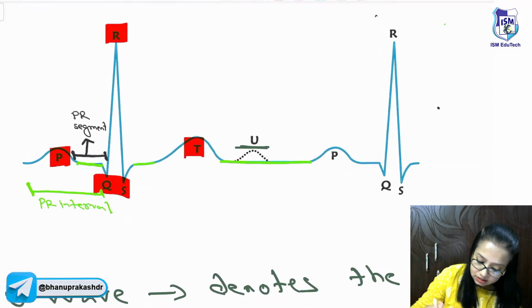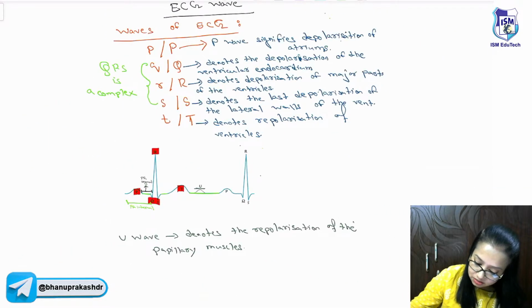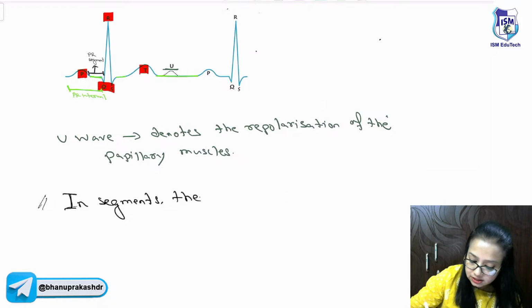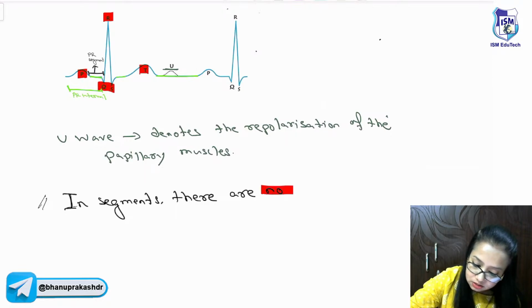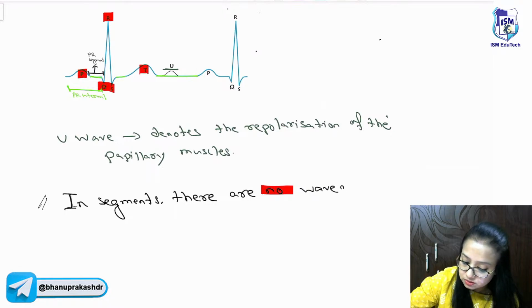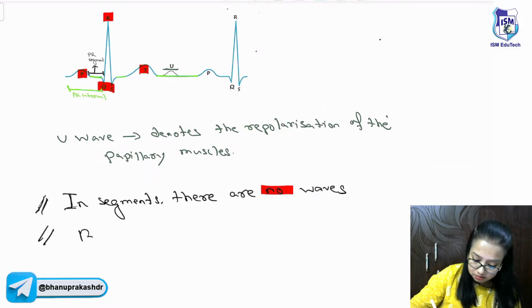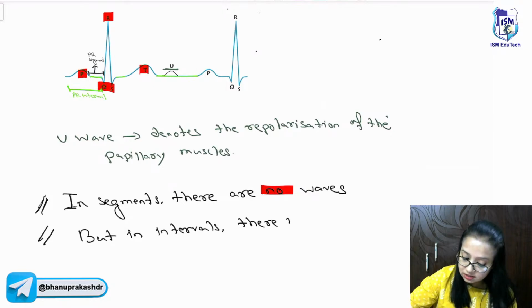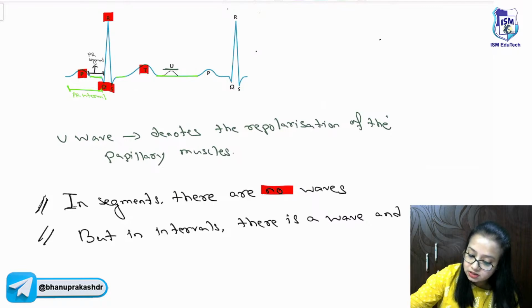Let me write it down here. In segments, there are no waves, but in intervals there is a wave and a segment.